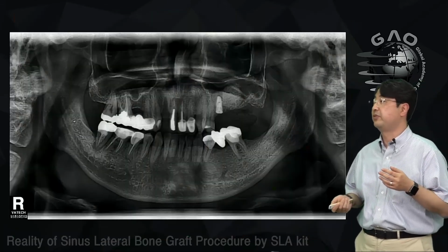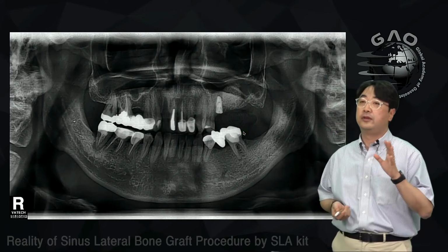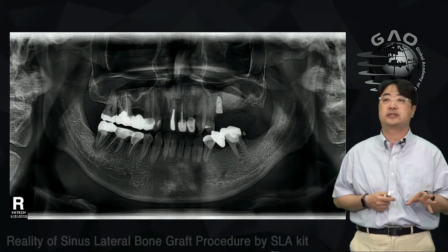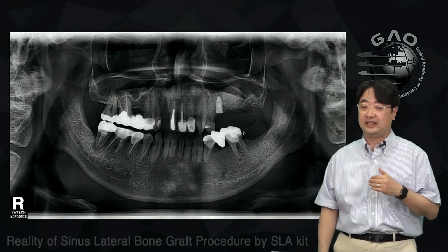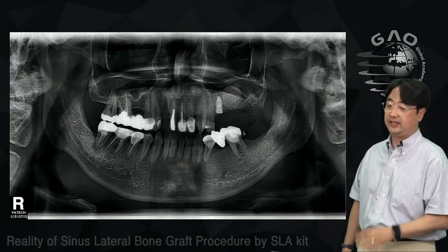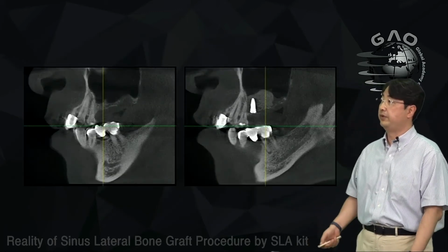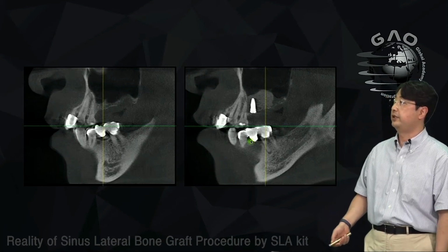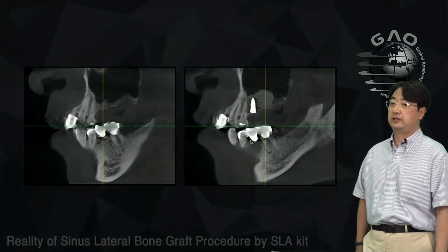Well, I haven't placed the implant for number 27. I'm going to place it later. But this way, you can use crestal and lateral approaches, mix and match together. They easily make sinus bone grafting possible in different situations, right? So this is a CT scan before and after. This is before, and this is afterwards.